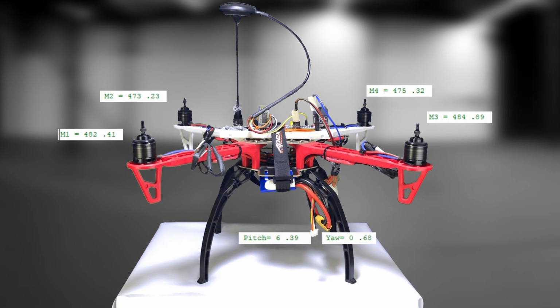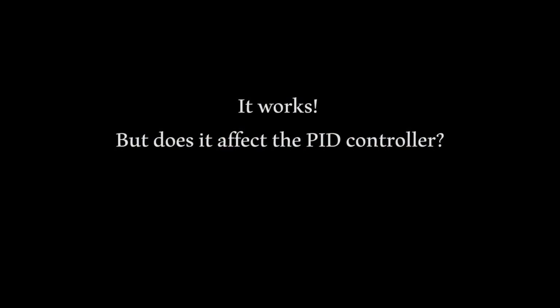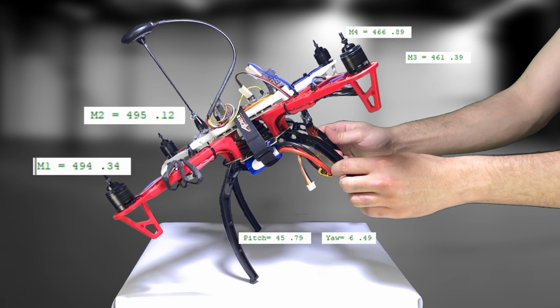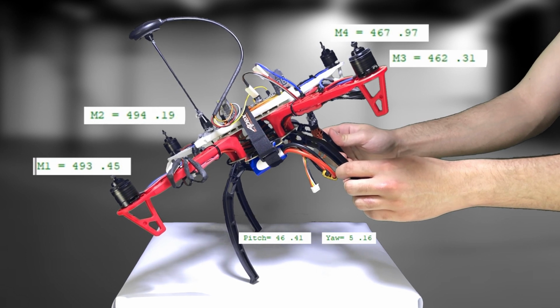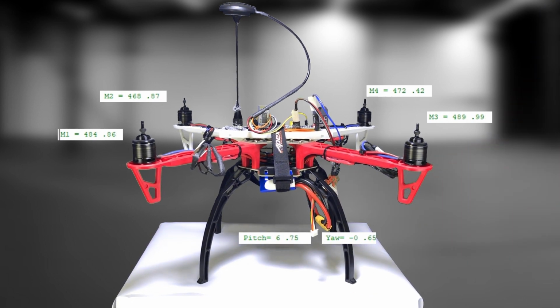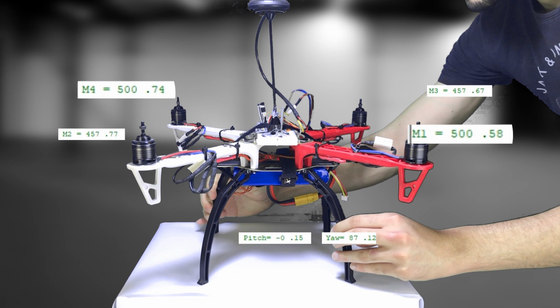Let's try rotating the drone around a different axis. That looks promising. However, did that resonate in the PID controller? Let's rewind back a little bit. As we can see, the motors on the left are pushing harder, trying to return the drone back to its target position. However, in this case, the motors on the diagonal are the ones that are pushing harder as they are trying to rotate the drone back to its location.